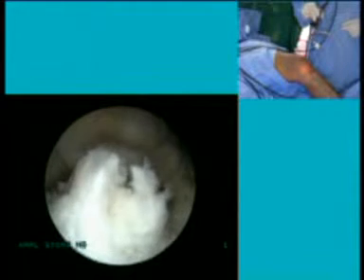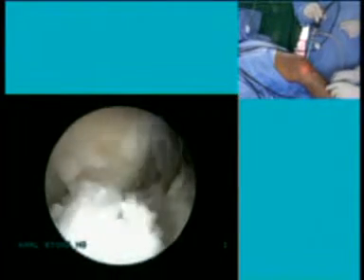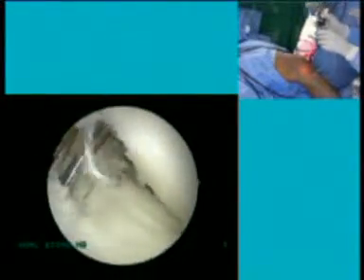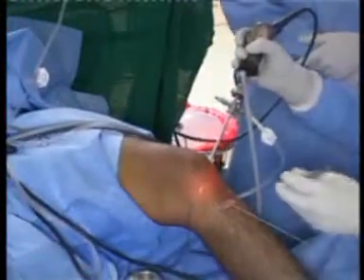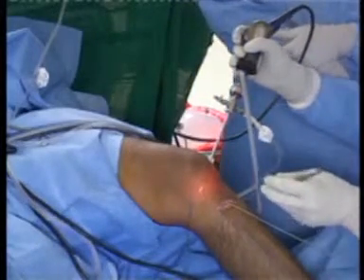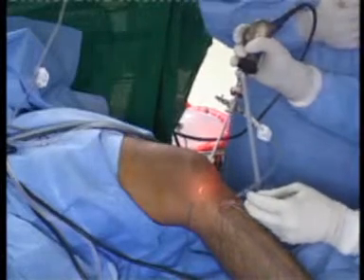Dr. Peterson, are you through with the tunnels in the tibia? Yes. Can we see the external landmark? Can we see where the guide wires are coming out on the tibia externally? The camera person needs to help us with a bigger external picture. You have an outside camera, you can see the divergence of the tunnels. One is here very close to the tibial tuberosity and one is pretty close to the medial collateral ligament.